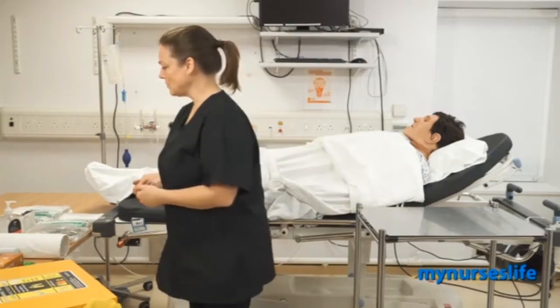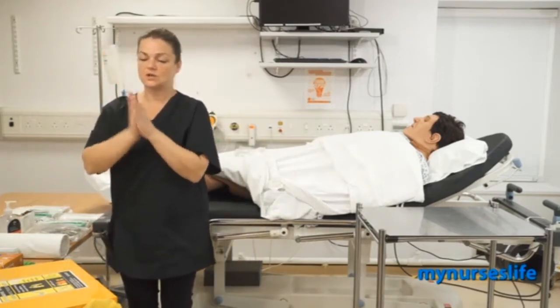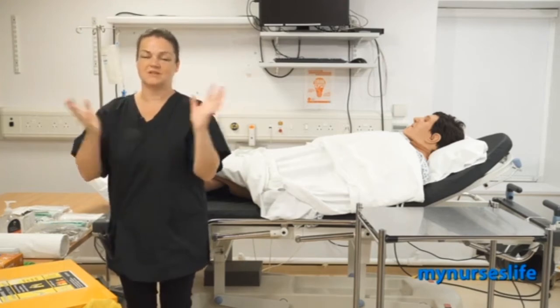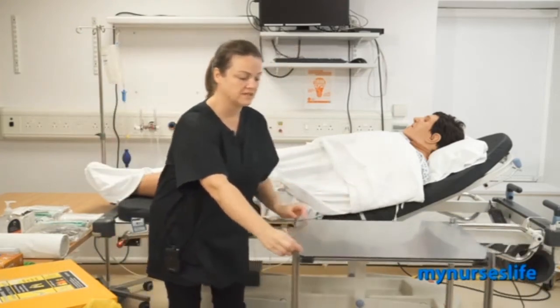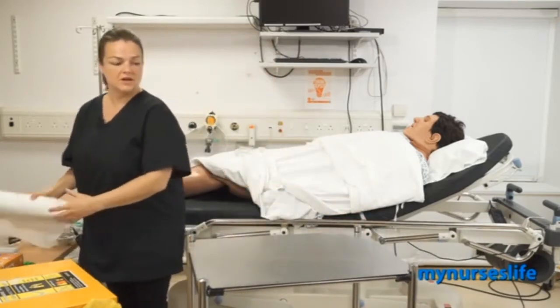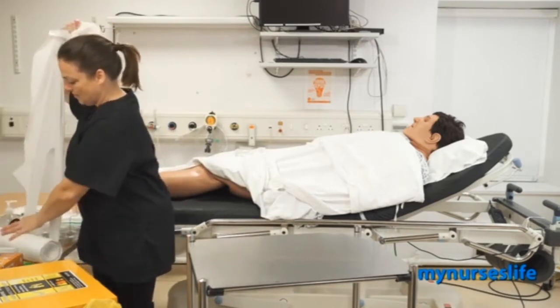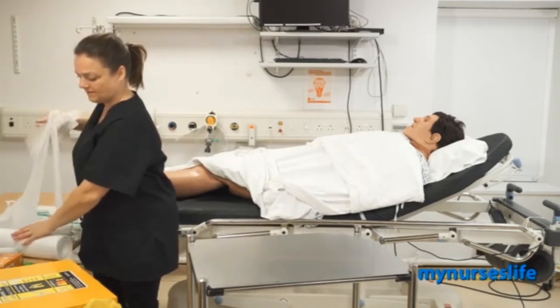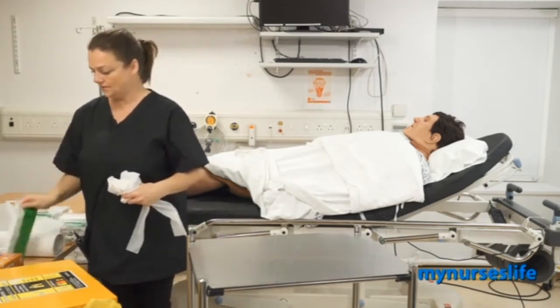Okay. So when you're leaving the patient area, make sure you gel your hands again. This is just a quick social hand wash. You don't need to do the 7 steps again. You will use a silver trolley like this one, so I would check with the examiner. This trolley has been cleaned with soap and water in the past 24 hours, but I'm going to give it a wipe with 70% alcohol wipes, like these ones.